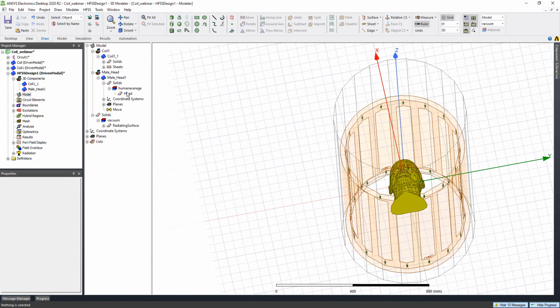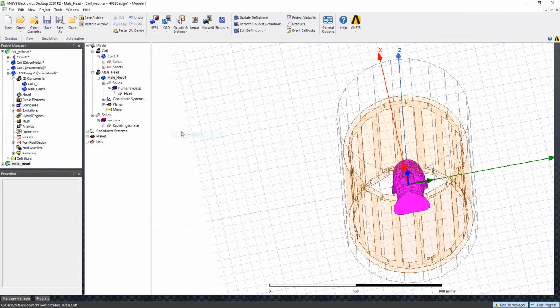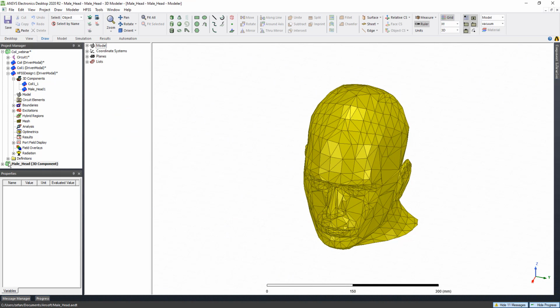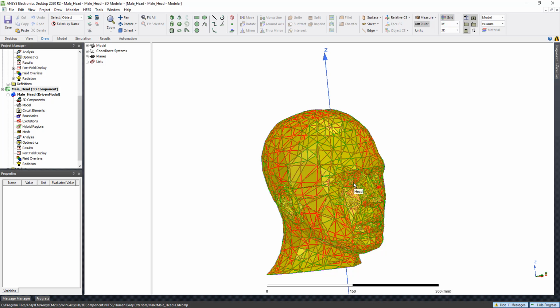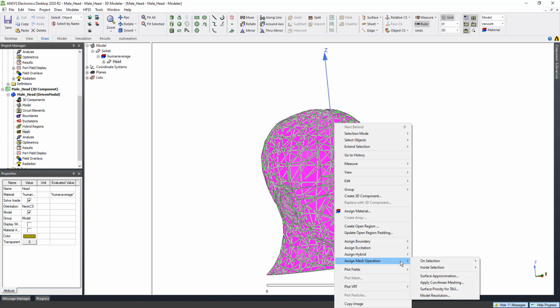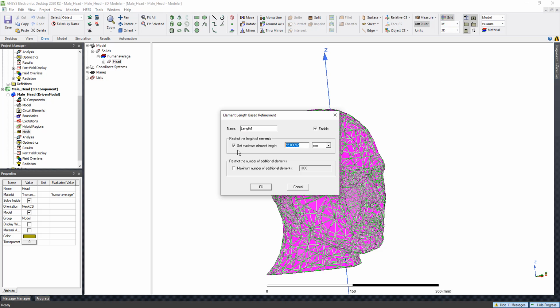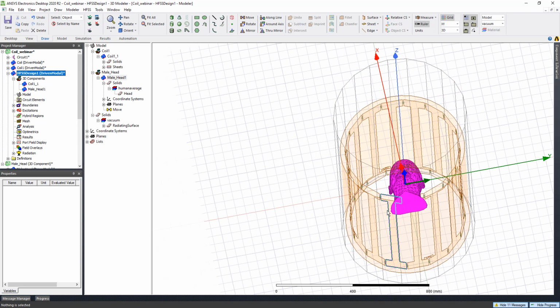Yeah, so what I need to do is go to the human head and assign it there. In this case, I can just edit definition to open the human head, because the human head is not an encrypted model, so I can do it. I can change it here. Yes, so now I just go ahead and do the same thing: select the human head, mesh. Right, so I will just set 50 millimeter, even though the default is like 50. If you save this, it will be saved automatically.